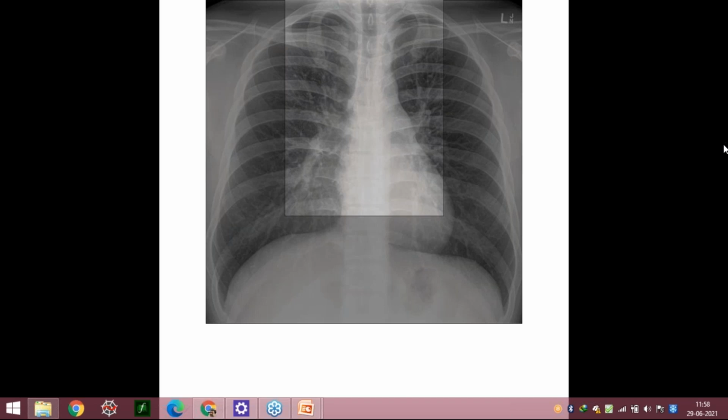In MR, wait a second, I have a question. In MR, a jet of blood may enter into a specific anomaly that can cause a. See, the very statement that you are writing here, in MR, a jet of blood may enter. Sorry, okay, I may have missed it. Yeah, so it can cause. So this is something which is possible. I am not saying that MR cannot have the upper zone congestion. But the common answer would be mitral stenosis.